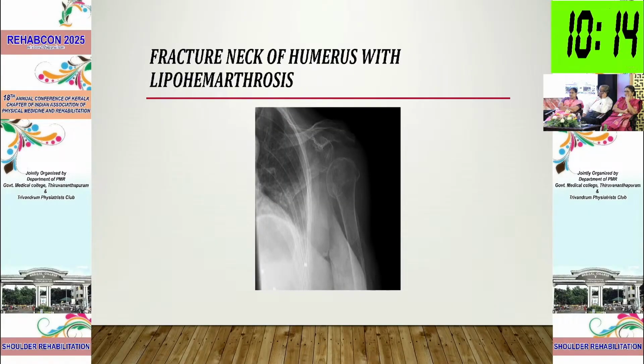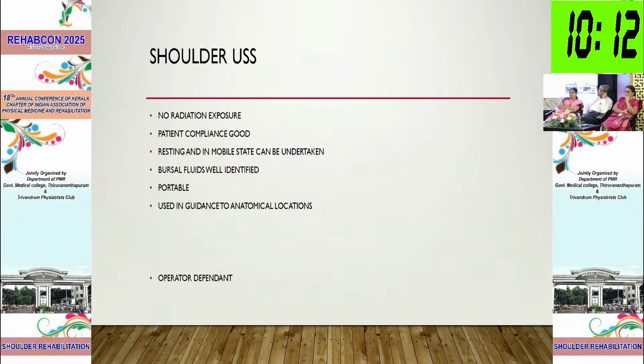What happens is that you have to give an idea regarding the multiplanar structures. For example, if you have a fracture of the neck, a fracture fragment is demonstrated in a plain X-ray, what is the advantage of CT, people may ask you.